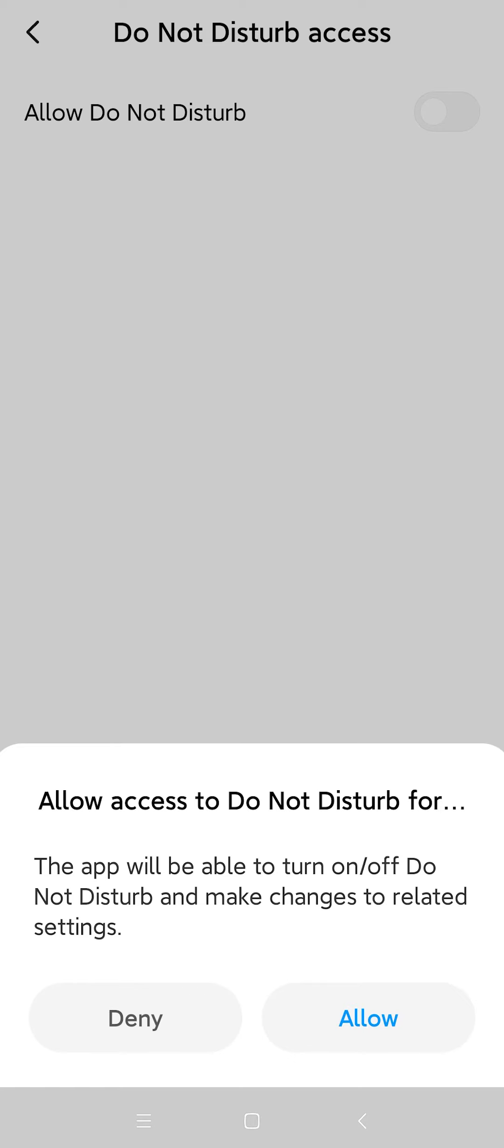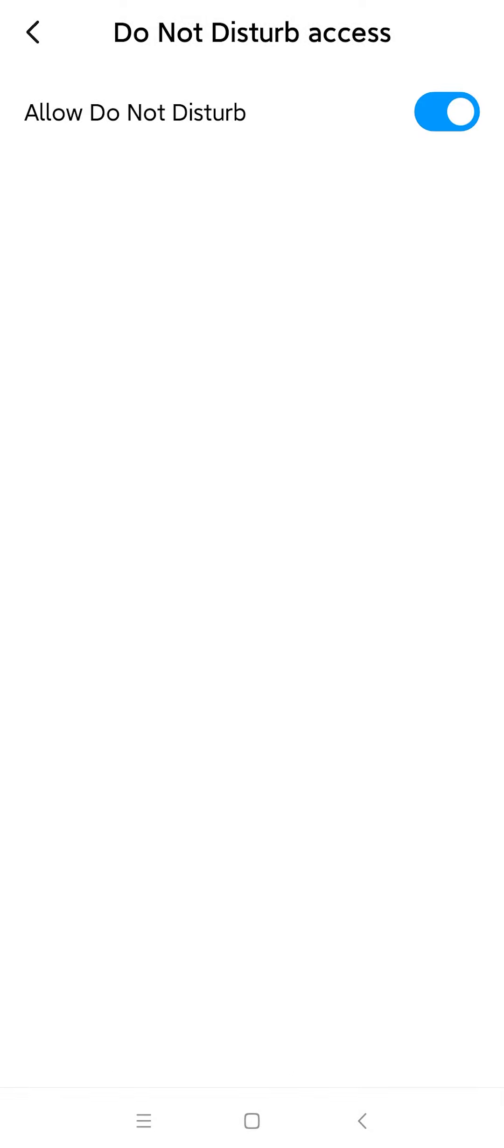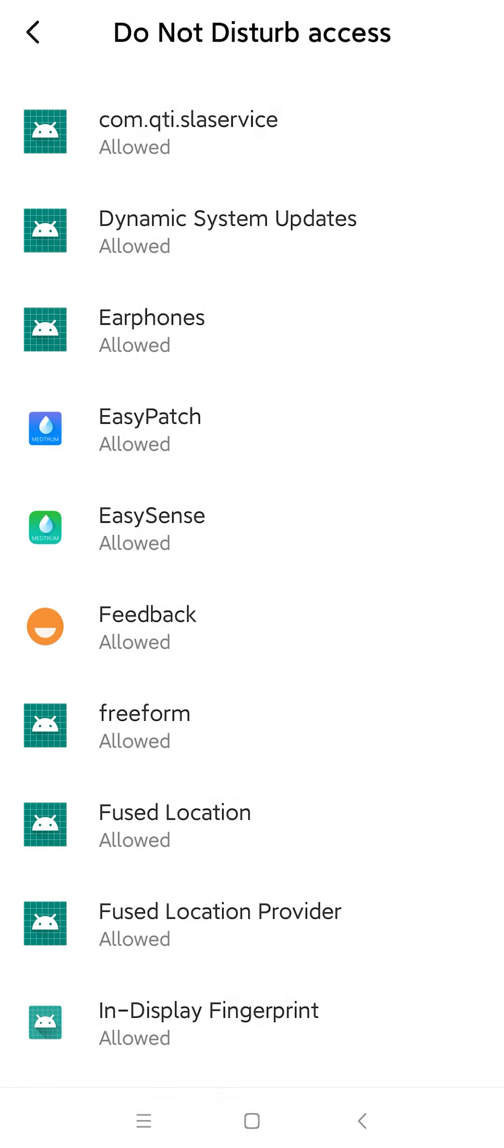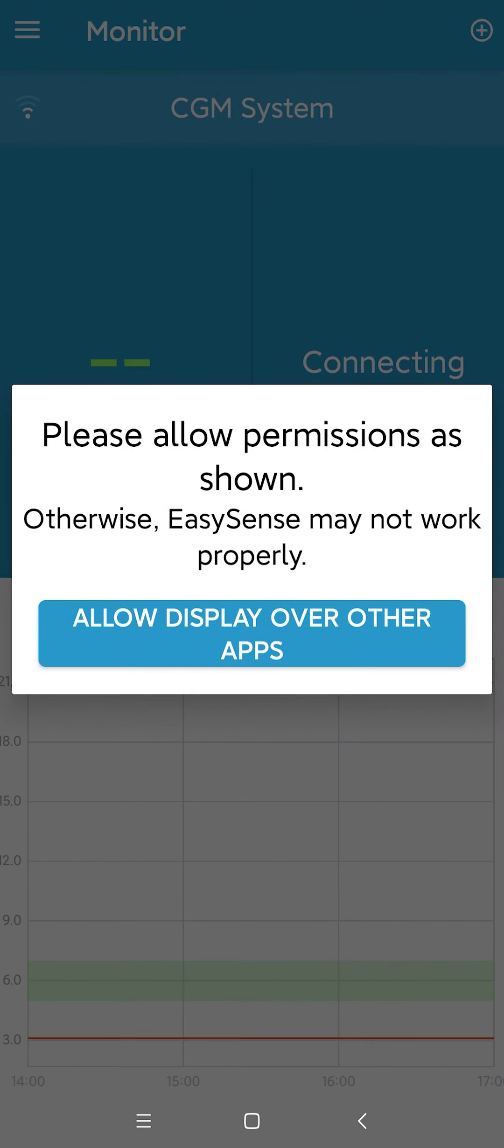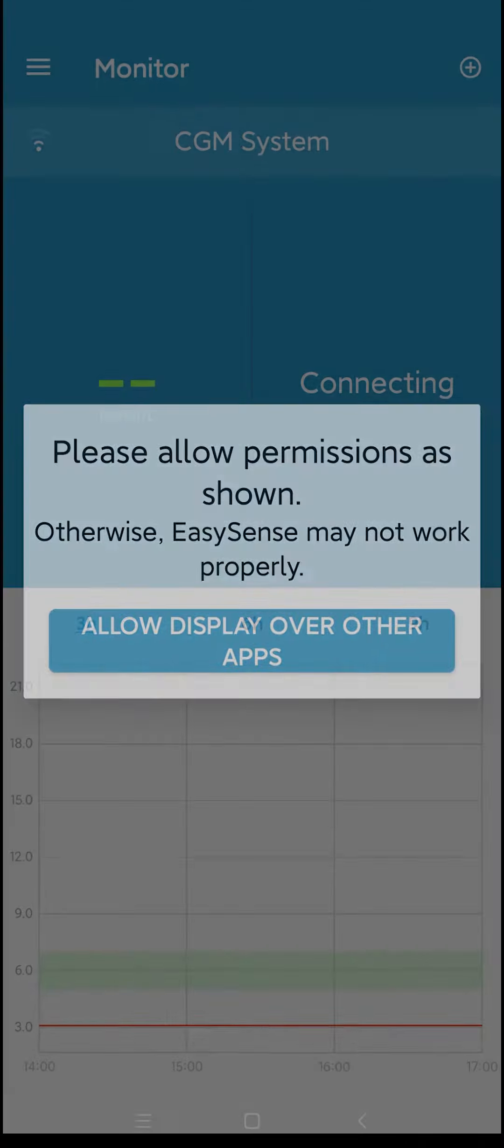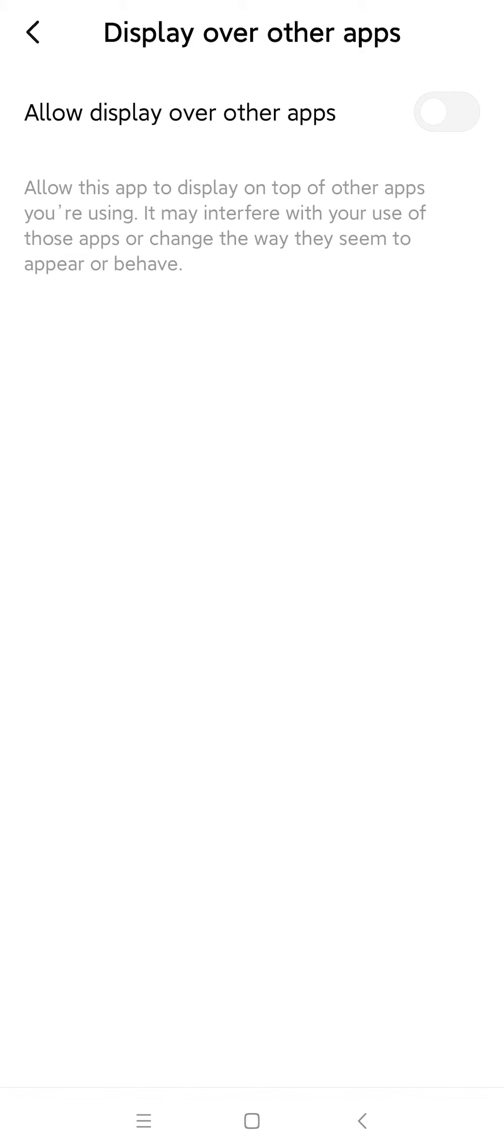Click Allow at the bottom of the pop-up window. Go back to the main page of the app and select the Allow Display Over Other Apps option, and switch it on on the following page.